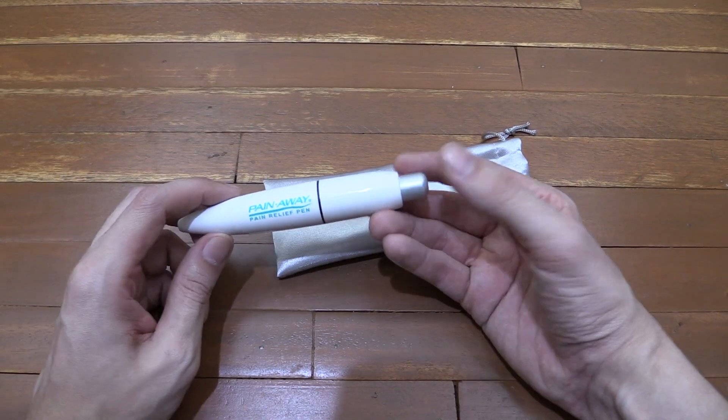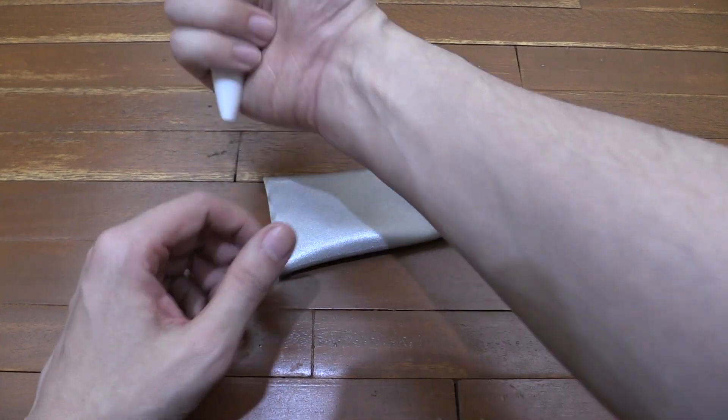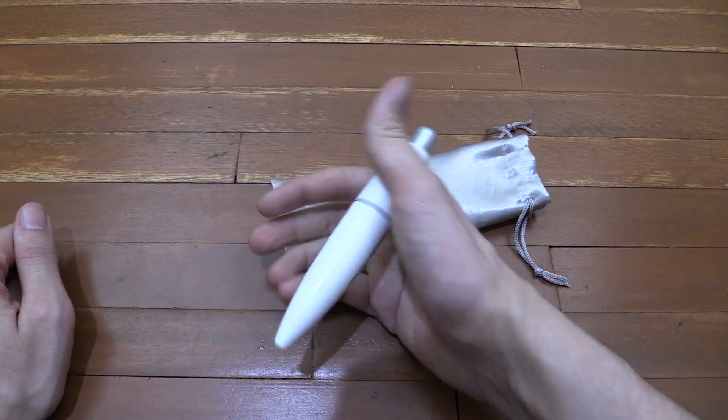Their advice is that if you don't want to follow acupoints, then use it directly where the pain is. For instance, if you have pain on your elbow, you can use it around that area.